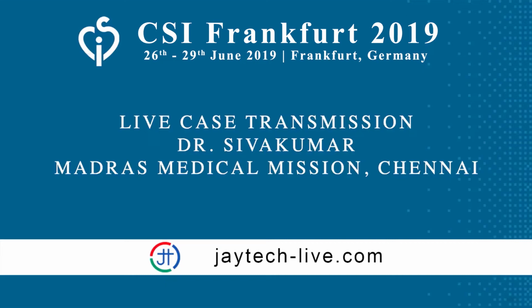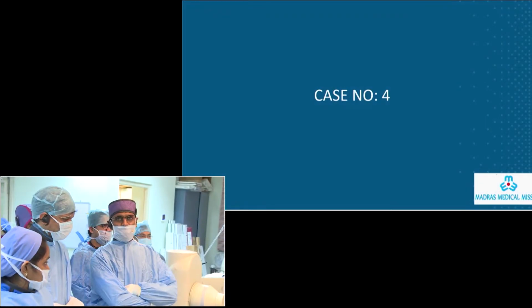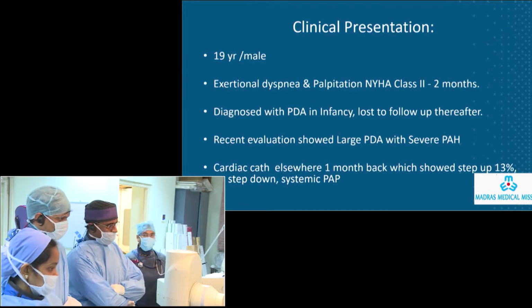In the session on cath lab efficiency, we want to show dealing with a large adult hypertensive ductus. Can I have the PowerPoint slides, please?